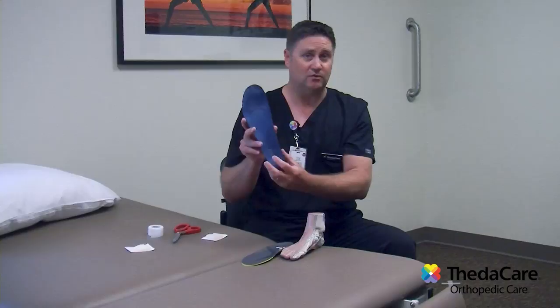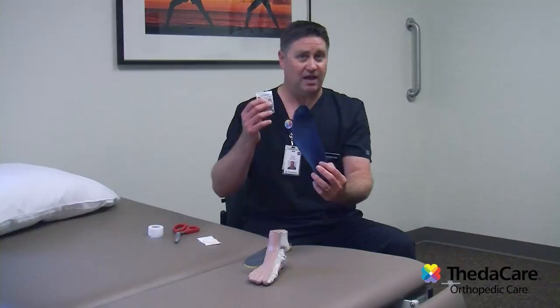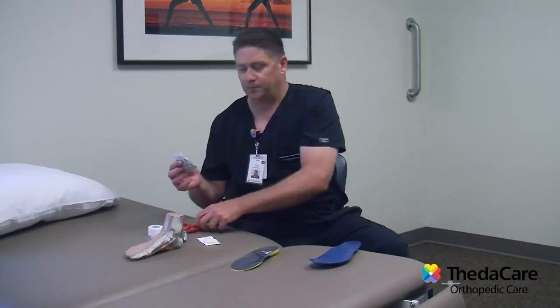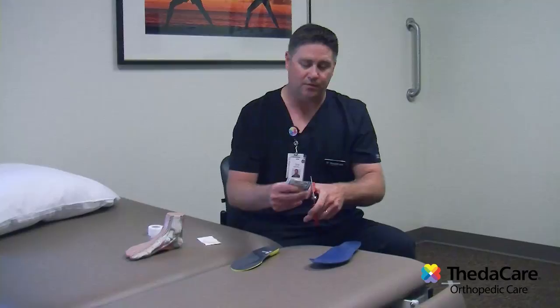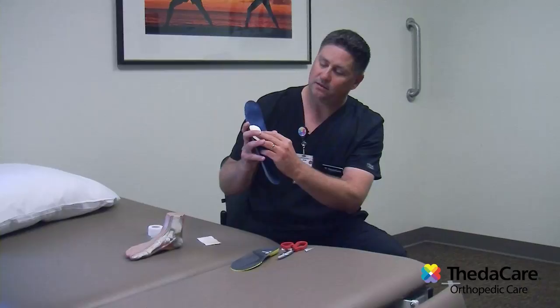You've been given one of these in the office called a metatarsal pad. There's a left and a right, so I'm going to do this left one on this insole. What you'll do is take a scissors and cut the paper around the outside of this pad. I'm using my insole that has been worn out, and I'm going to place the pad just like that.